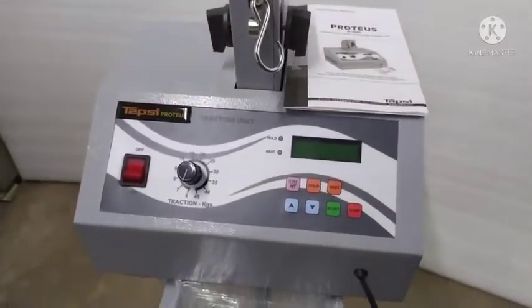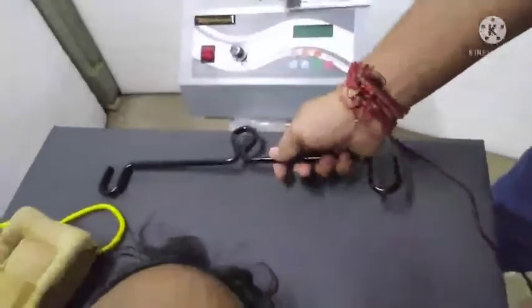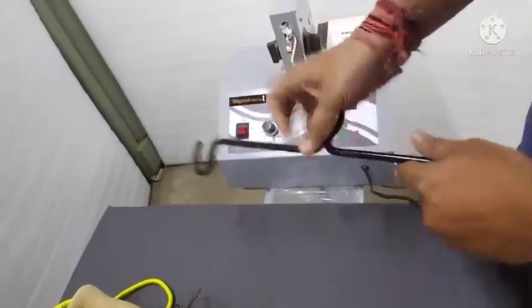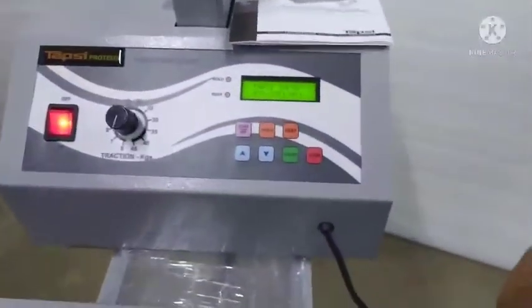Now we see how to give cervical traction to the patient. So this is a traction unit, and for giving cervical traction we need the cervical spreader bar and cervical collar. So now we start. We have to turn on the machine.